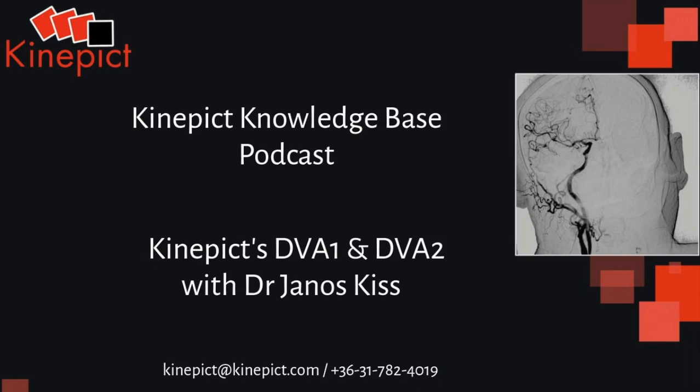Well, exactly. That is one of the major advantages of DVA2, because our preliminary clinical data show that if we use the DVA2 algorithm or processing method for lower limb angiography acquired under conditions where CO2 was used as a contrast agent, the image quality is dramatically improved.